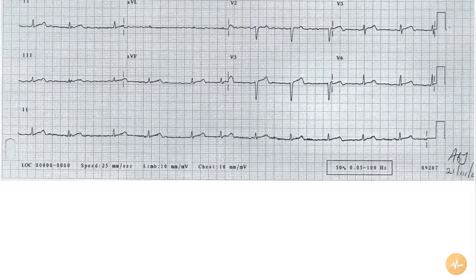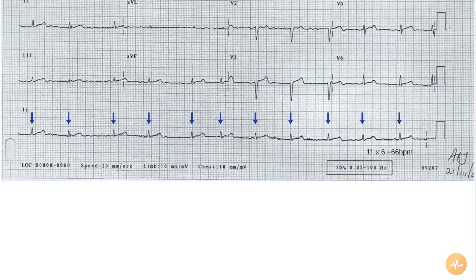The rate is 66 beats per minute and the rhythm is irregular and chaotic with absent P waves. This is atrial fibrillation.